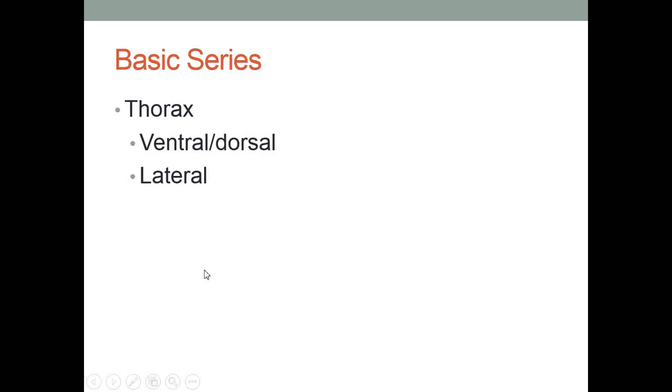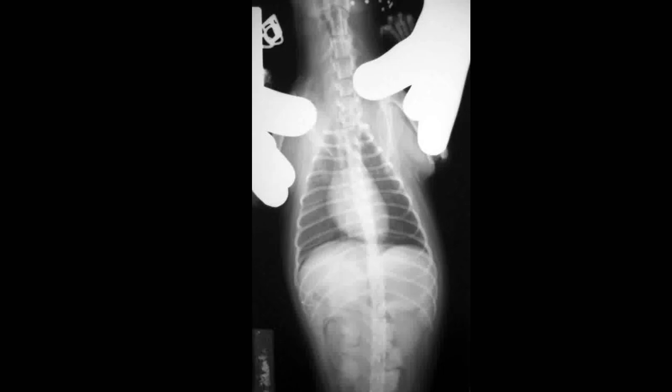Thoracic series, again, VD and lateral for thoracic series. Here's a VD on this. Here's a lady trying to hold the animal. Most veterinarians will sedate animals prior to taking radiographs, but sometimes the owner won't let you, or you're just not able to because of the animal's health.